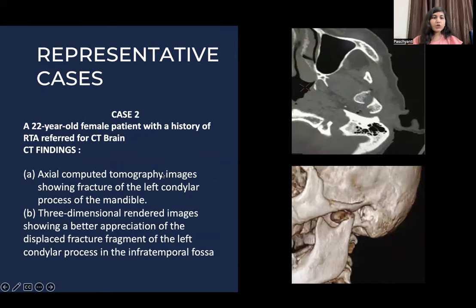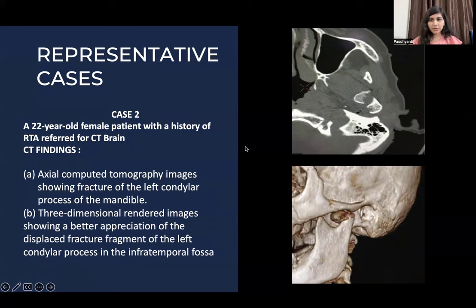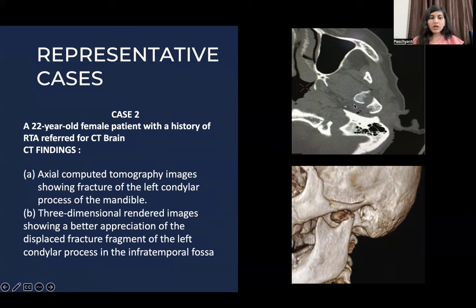Case 2: A 22-year-old female patient with a history of RTA was referred for CT brain. In the axial CT images, a left condylar process fracture of the mandible is seen. The 3D rendered images show better appreciation of the displaced fracture fragment of the left condylar process in the infratemporal fossa.